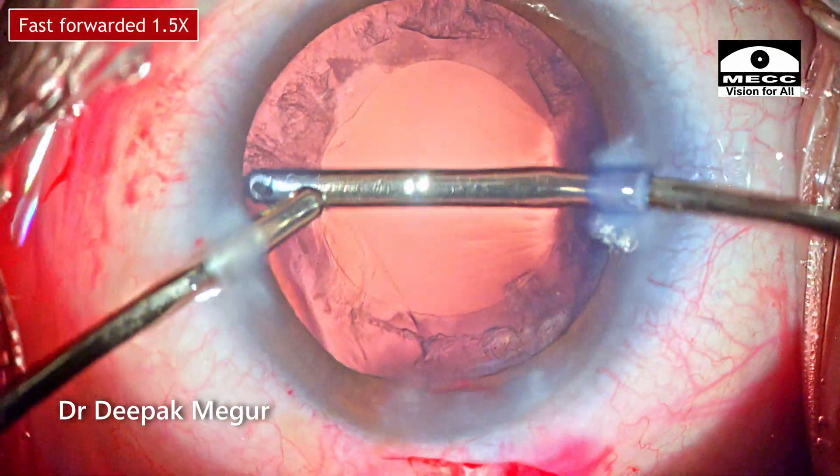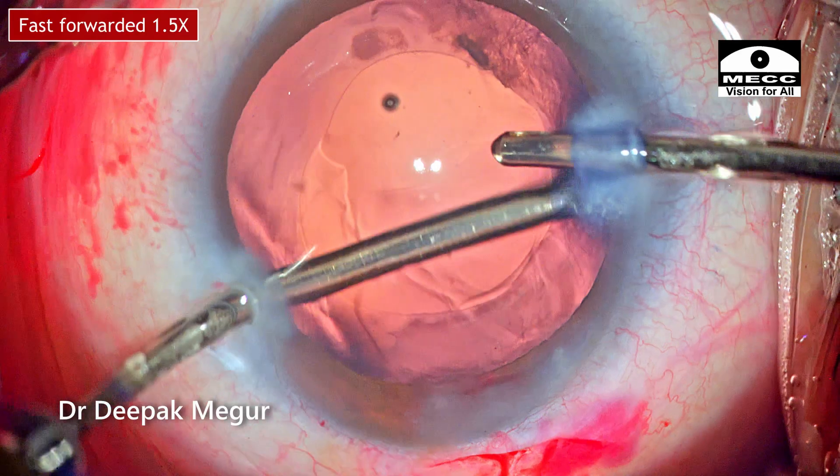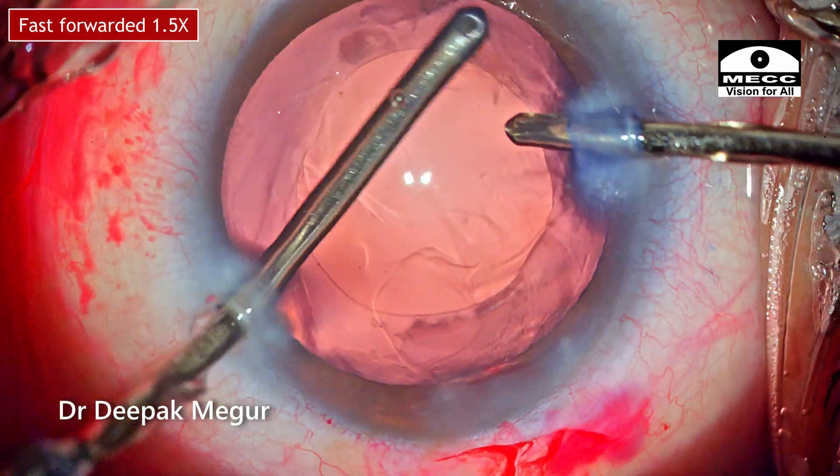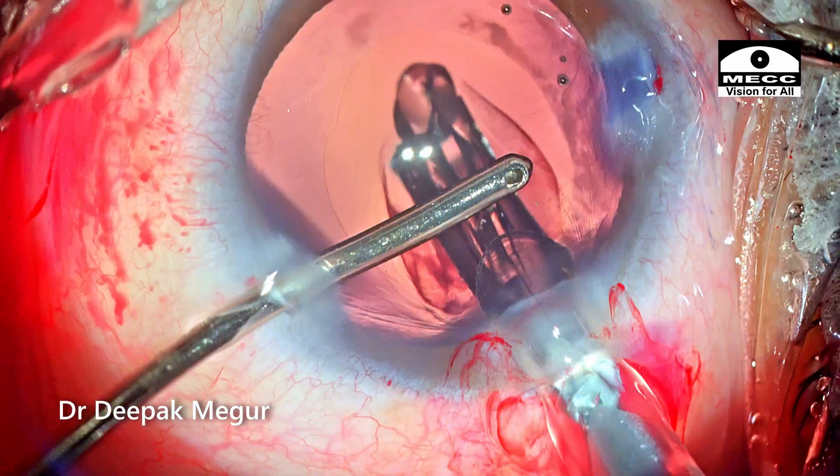The remaining cortex is aspirated, and the intraocular lens is placed into the bag.